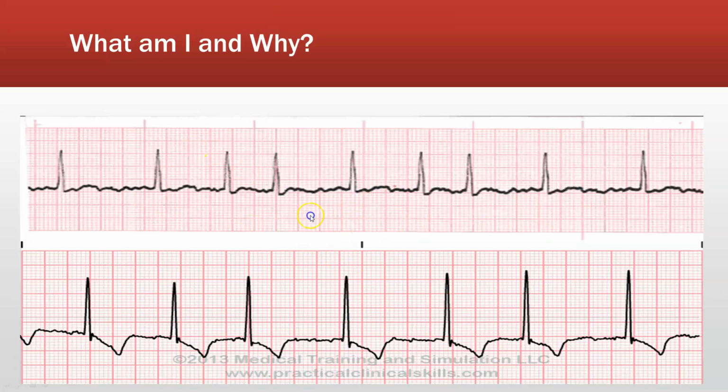And again, I put these on here. They are the exact same rhythm. This first one is very noticeable as AFib. It's right on that cusp of being tachy. The reason I put the second one here is that it's a little harder to notice. But what I do notice is that there is no identifiable P wave, and then I also have this T wave inversion. So then that's going to make me look a little closer.